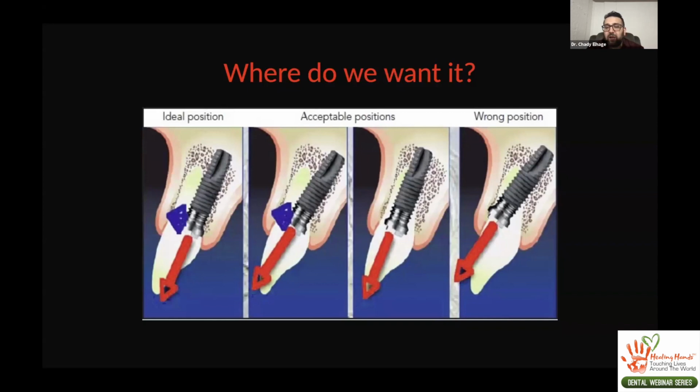And that's fine in a lot of cases. We still, just as we look at our ridges and where our implants are going to be and how the restorations fit on top of it, also look at how this restoration is going to fit in place. If I'm replacing a central incisor and my implant is going to be very facially angulated, well, if it's not going to allow me to develop an ideal restoration that is acceptable to the patient, then this is something we have to take into consideration.